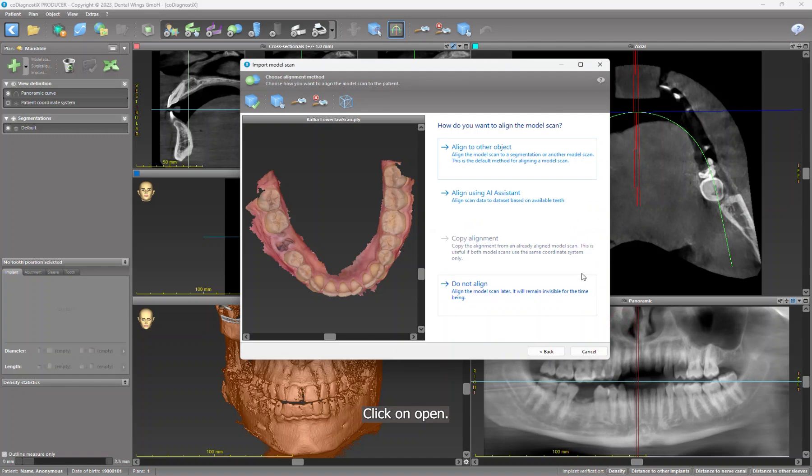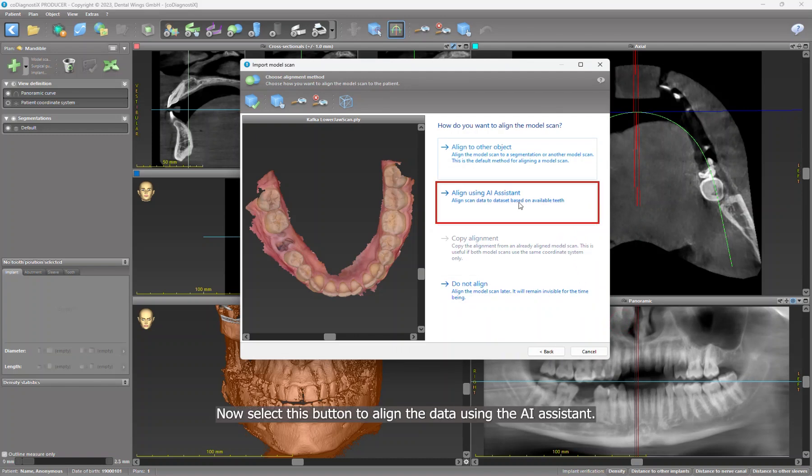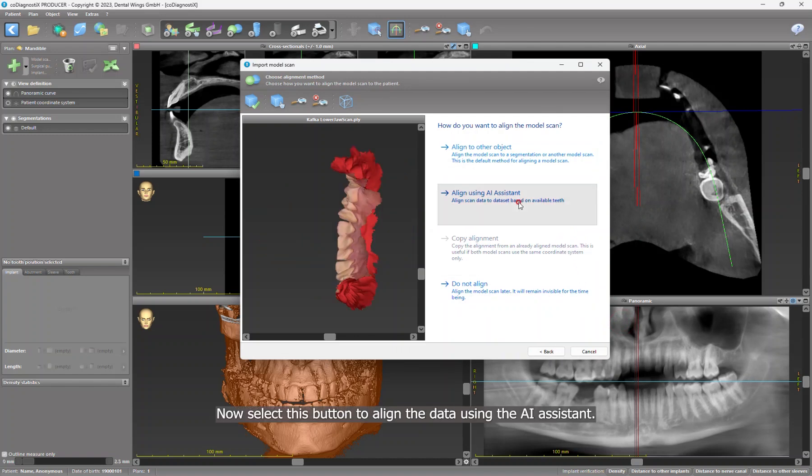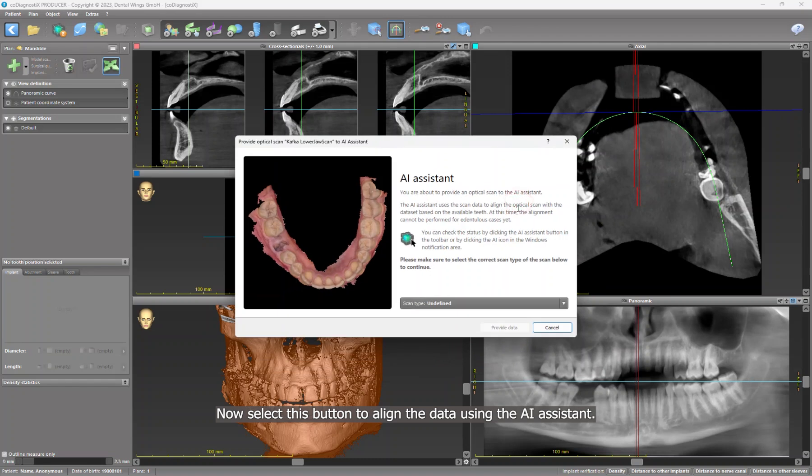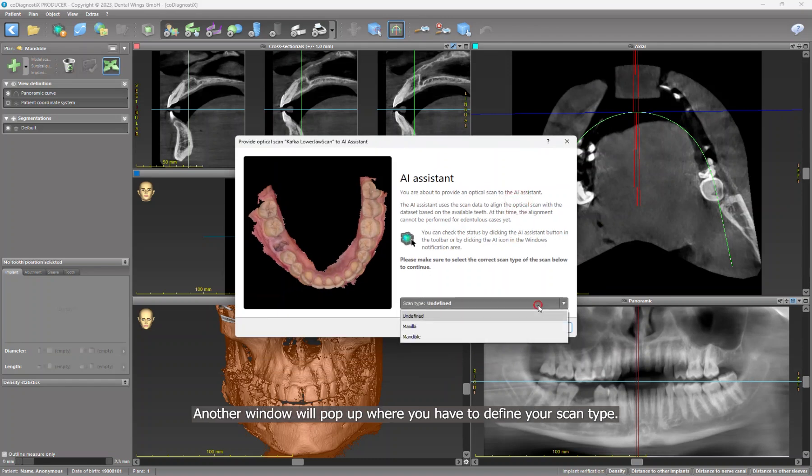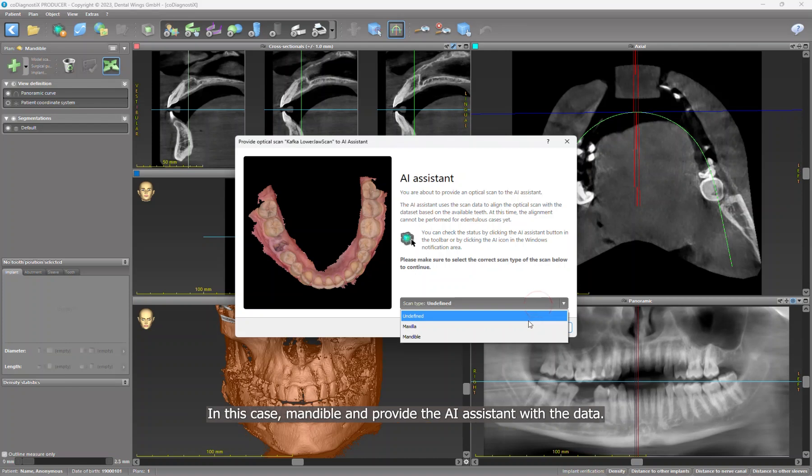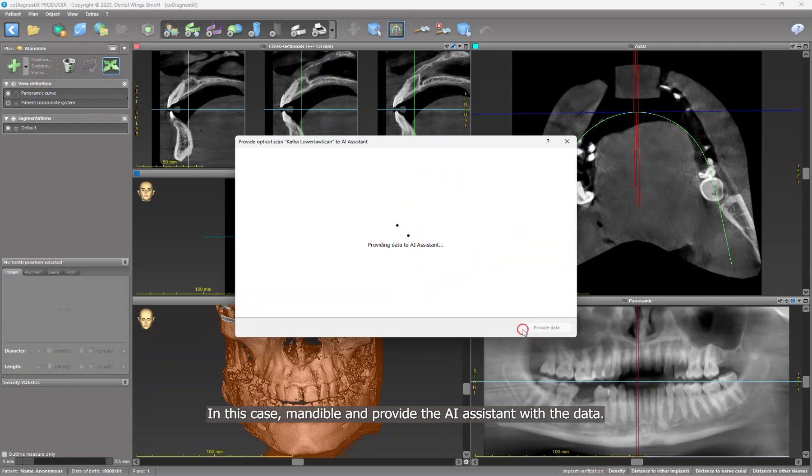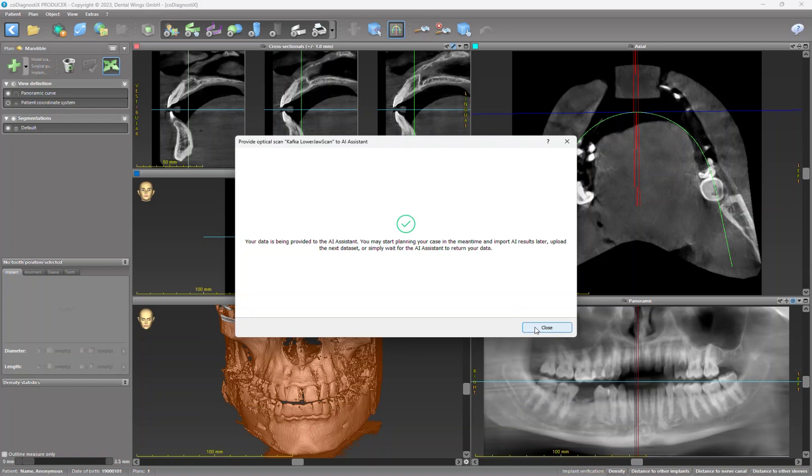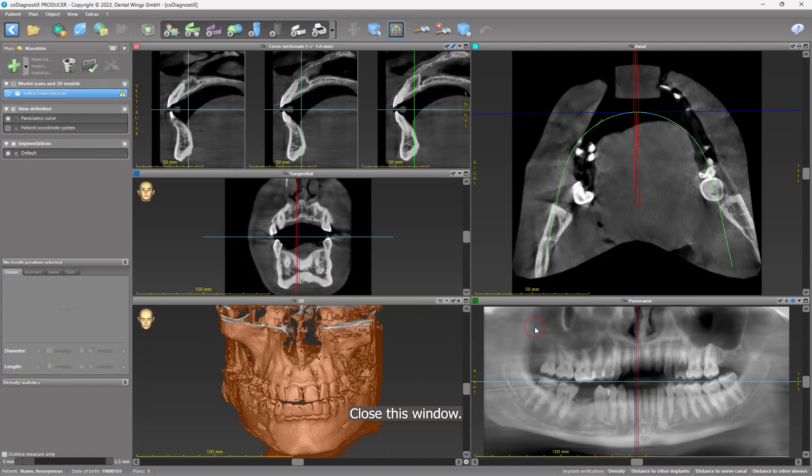Click on Open. Now select this button to align the data using the AI assistant. Another window will pop up where you have to define your scan type, in this case Mandible, and provide the AI assistant with the data. Close this window.